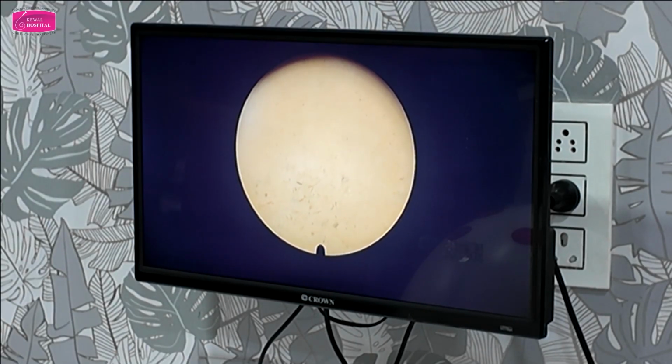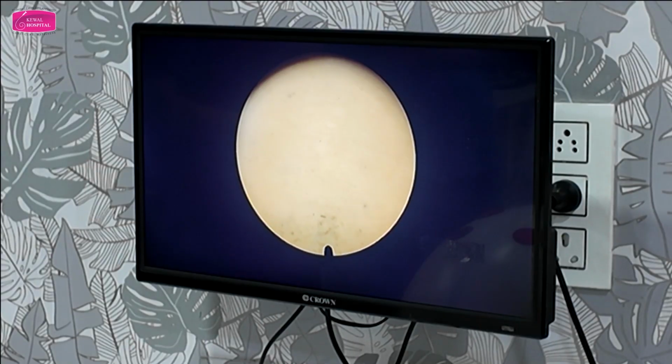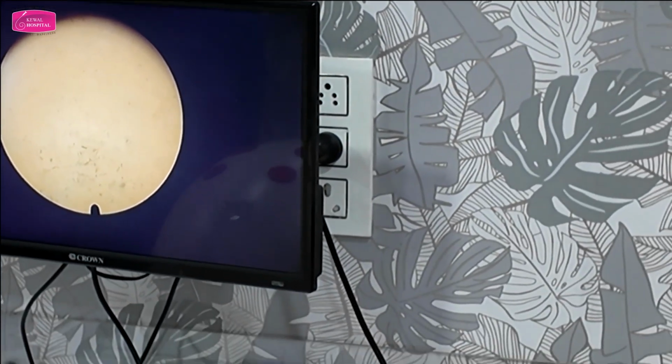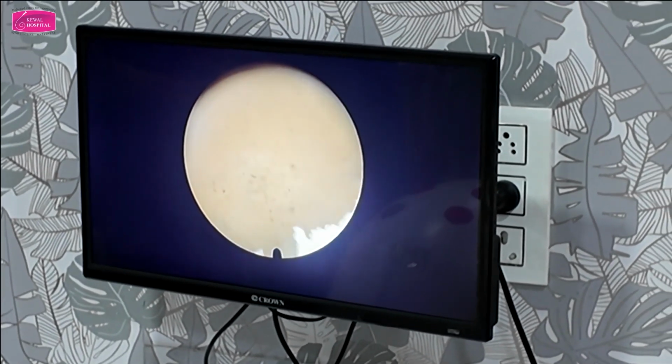Correct? Examine all over. And then suppose there is some pathology inside. What pathology you want? Polyp. Then how you resect the polyp? See, you can resect the polyp with scissors also. If it is a small polyp like 0.5 centimeter polyp or 1 centimeter polyp. Guys, the instrument is okay. So you can do it with scissors also. Every time you don't need a resectoscope. If the patient is infertility, I would recommend you to use cold scissors in spite of resectoscope for doing the operative hysteroscopy, right?